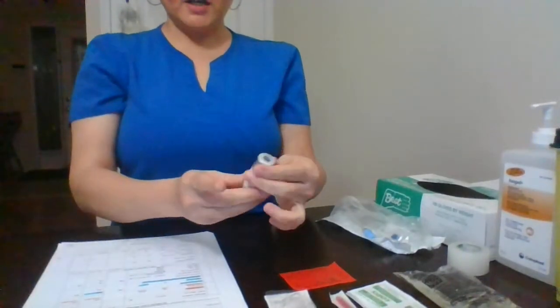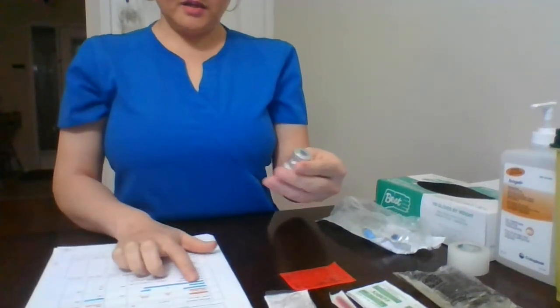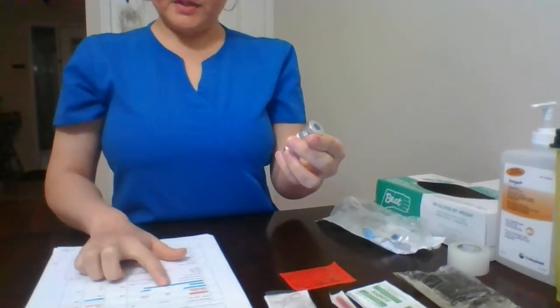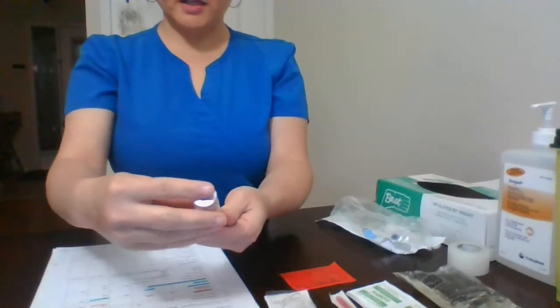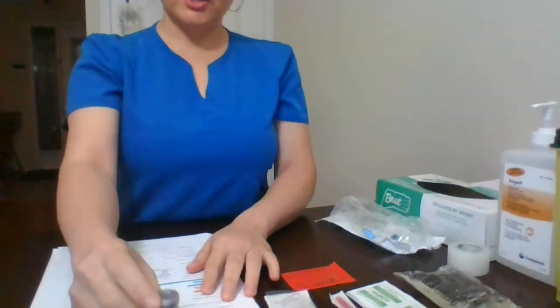So I have my medication here. We have pantoprazole, 40 milligram every 6 hours via IV. And I will also check the expiry date, which seems fine on our medication.